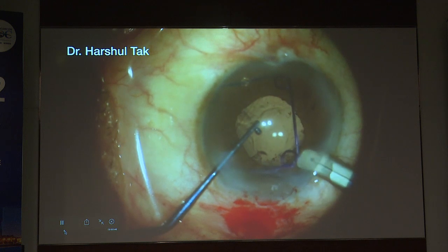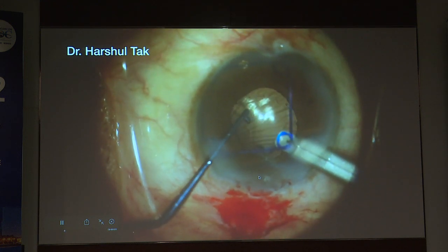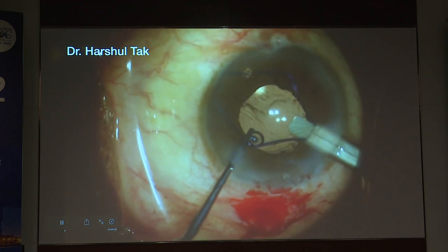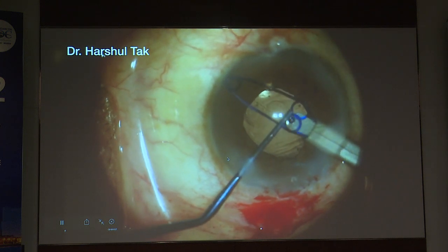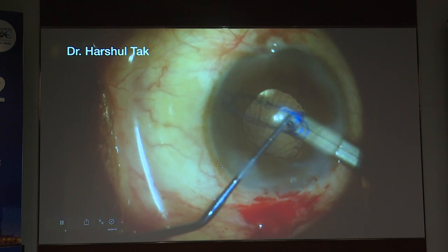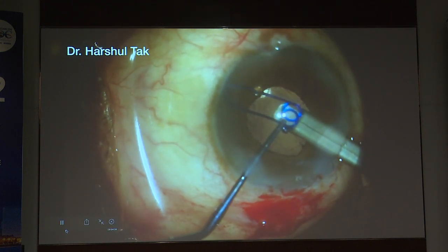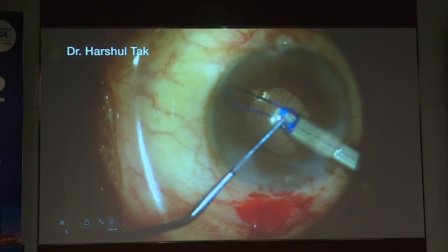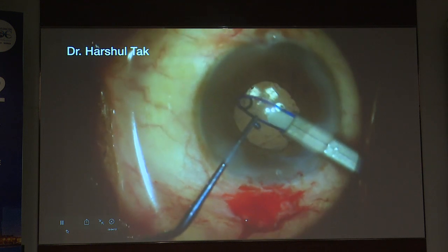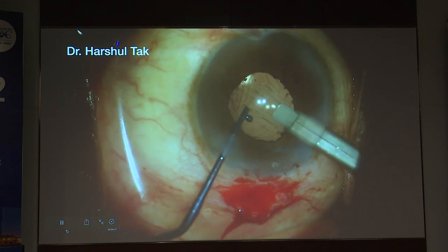You need to engage with this finger-shaped metallic thing, and use Kuegelin's hook from the side port to guide both these lateral scrolls into the tube, so that when these lateral scrolls go in, you can just pull on the proximal scroll which comes out. So this is another way you can take this ring out.